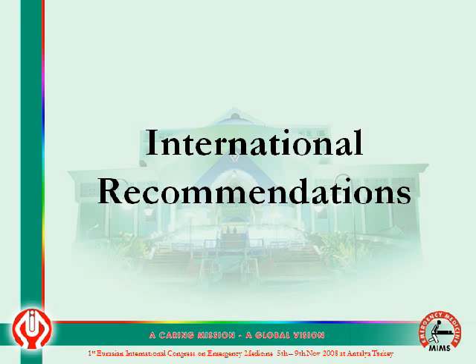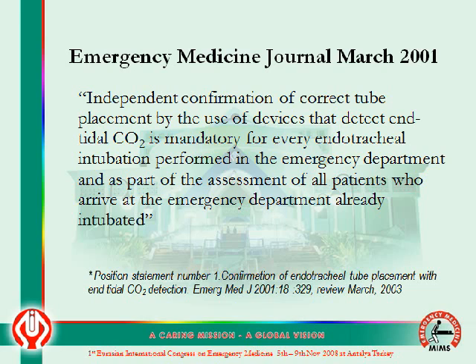What are the international recommendations already in place as far as tracheal intubation and tube position are concerned? The Emergency Medicine Journal in March 2001 placed their position statement. It states that independent confirmation of correct tube placement by use of devices that detect end-tidal carbon dioxide is mandatory for every tracheal intubation performed in the emergency department and as part of the assessment of all patients who arrive at the emergency department already intubated.